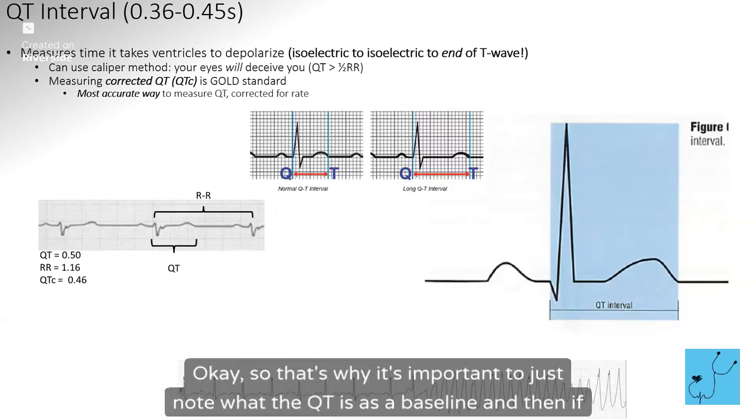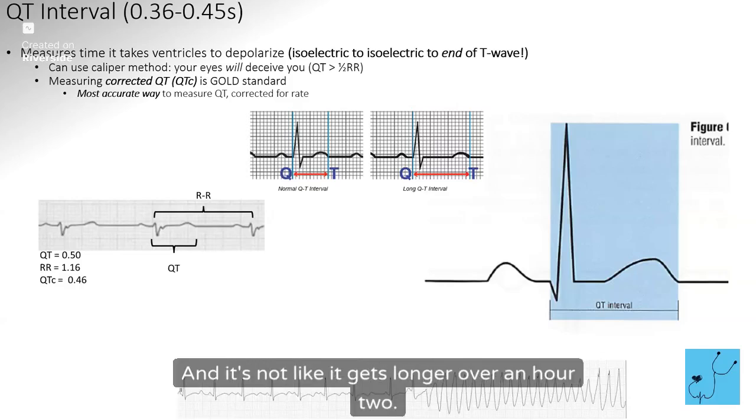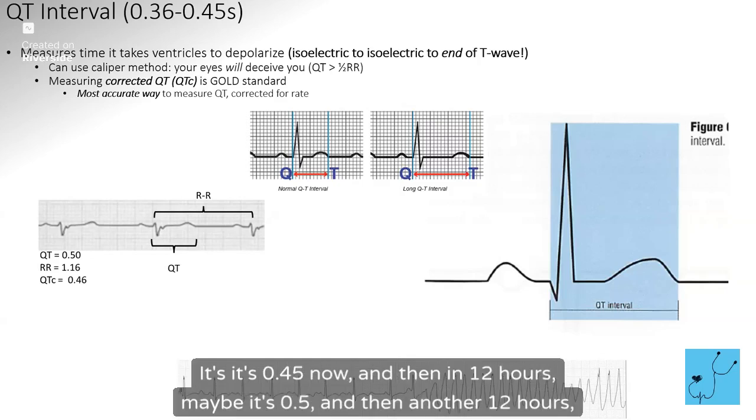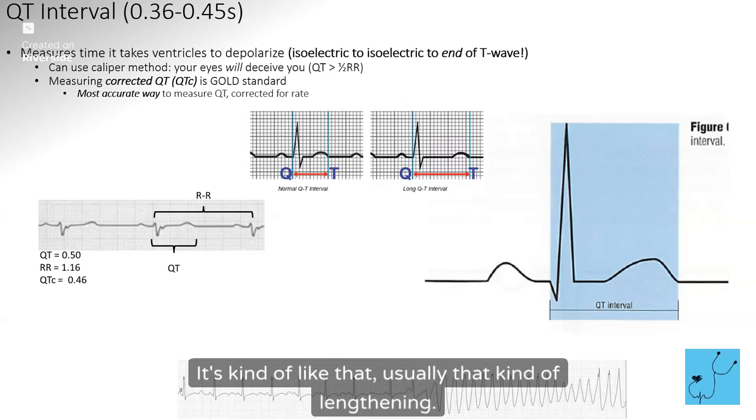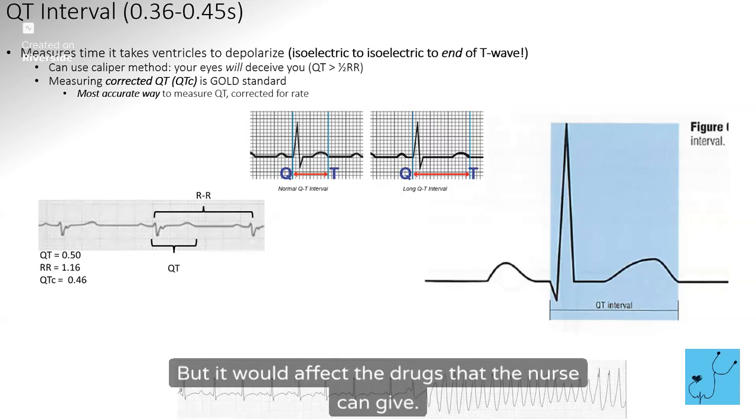Okay, so that's why it's important to just note what the QT is as a baseline and then if it's getting longer. And it's not like it gets longer over an hour or two. It's like it's 0.4 or 0.5 now, and then in 12 hours, maybe it's 0.5, and then another 12 hours, it's 0.55. It's usually that kind of lengthening. But it would affect the drugs that the nurse can give.